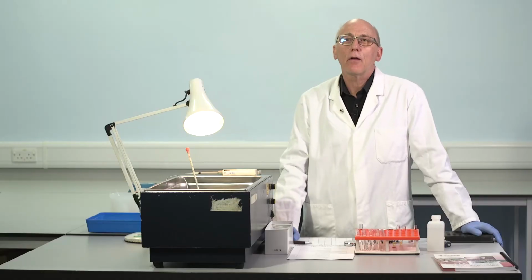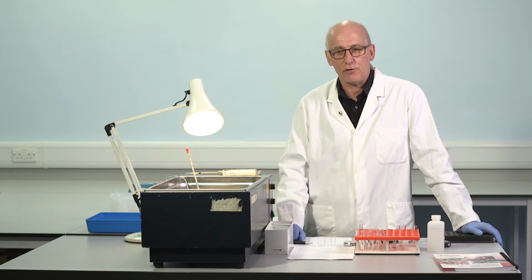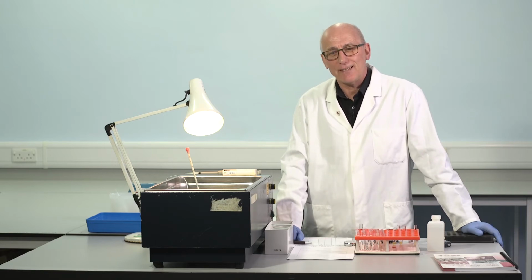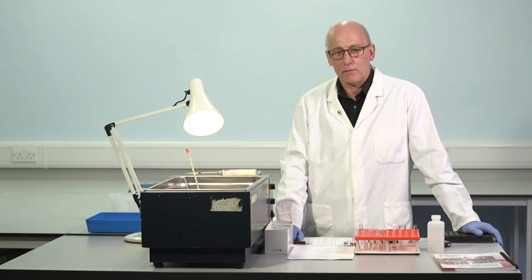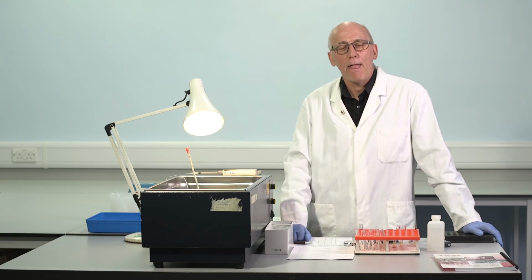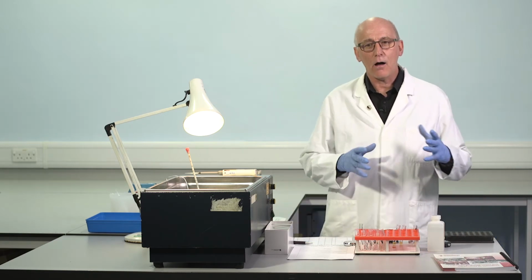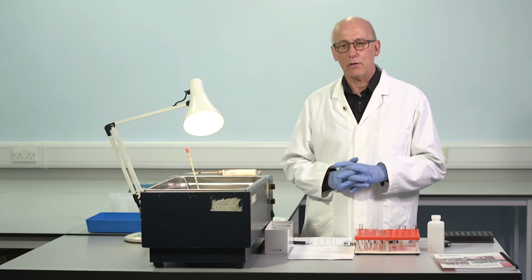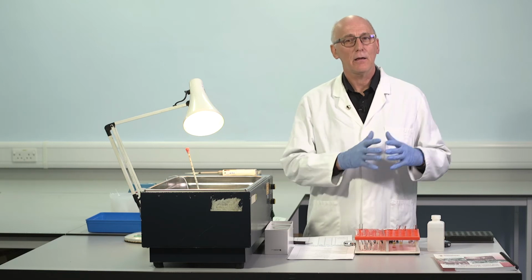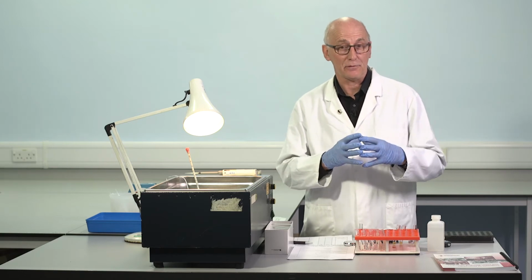Okay, so we know that these tests can be performed with a whole series of different APTT reagents, the same ones that might be used for APTT determination, obviously. And we know that these reagents contain very different phospholipid concentrations. So is that important? Well, it can have an important influence on the results here. Reagents which contain a high concentration of phospholipid are much more likely to be unaffected by lupus anticoagulant, antibodies which block the phospholipid sites where clotting factors are assembled and complexes are assembled.